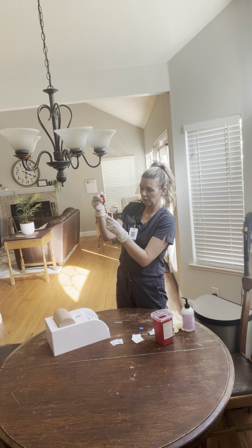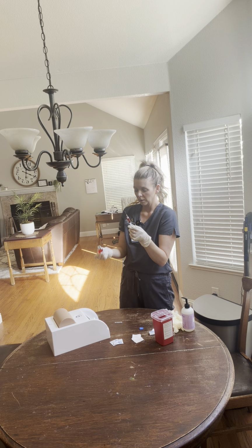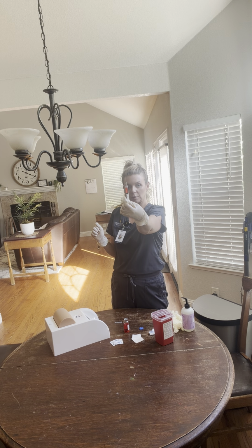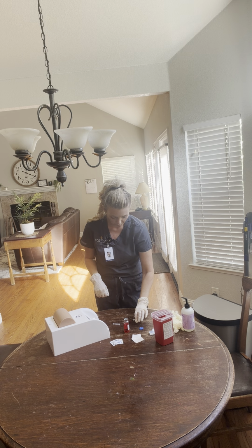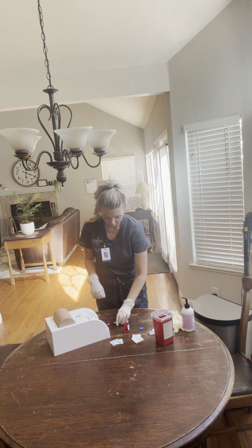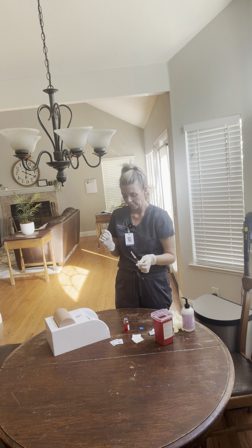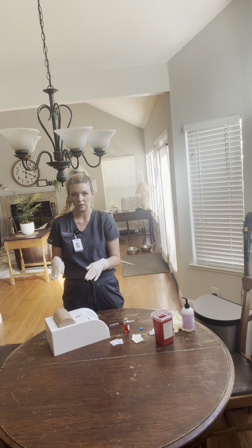Okay, so I am good. I have no air bubbles at this point. So I'm going to take my vial and place that down, and I'm going to show the camera. I have 1.5 milliliters. I'm going to scoop the cap using the one-hand scoop method, and I'm going to cap that. At this point, I'm going to look at my patient's skin integrity.